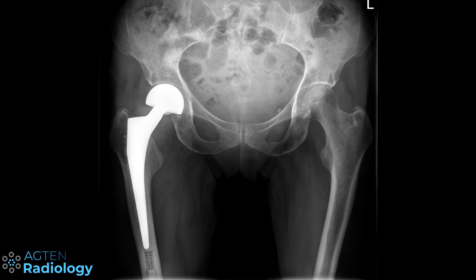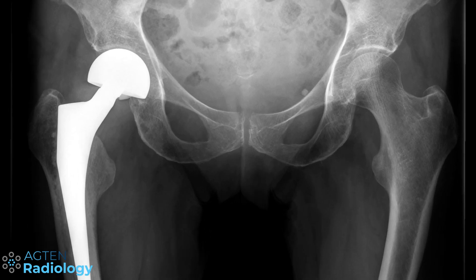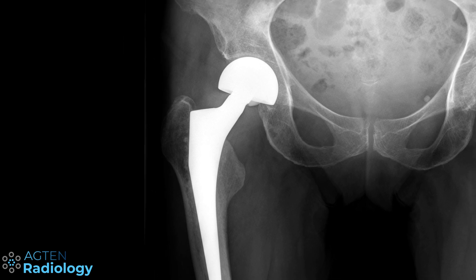I'm pretty sure some of you would just go over this case and describe it as: okay, there is a total hip arthroplasty on the lateral side. Maybe some of you might even say the cup is a little bit in malposition, etc. But let's zoom in a little — this is actually just a hemiarthroplasty.